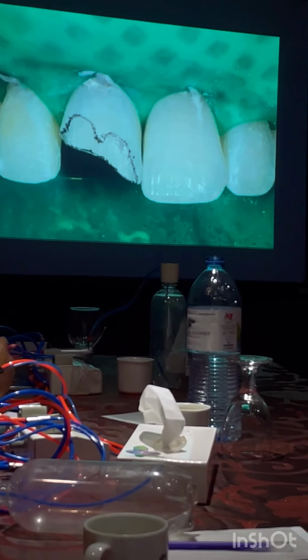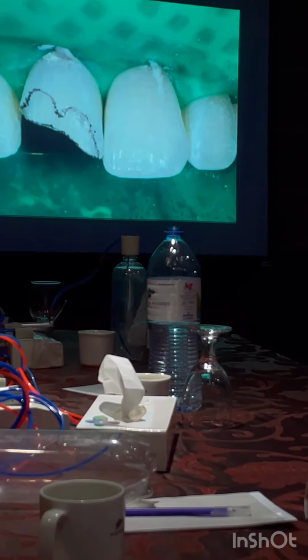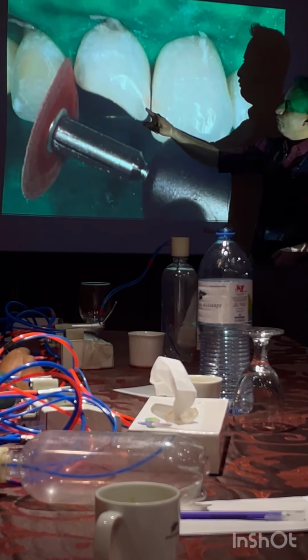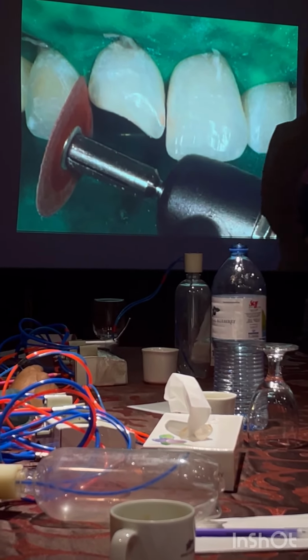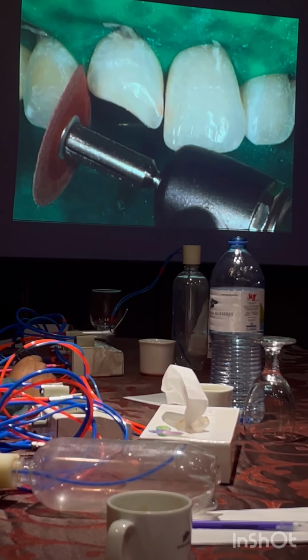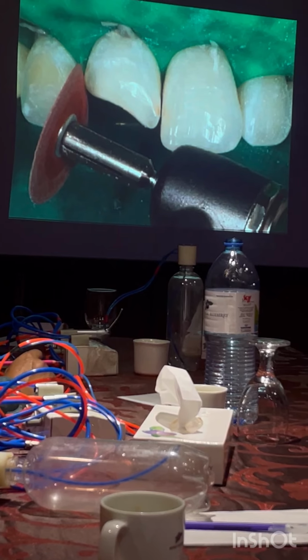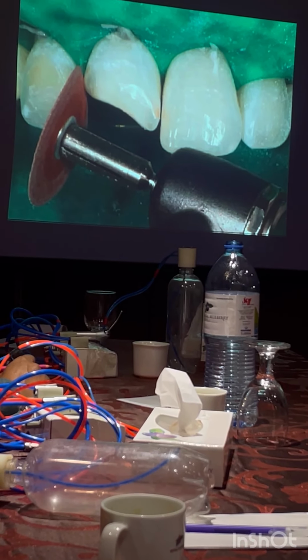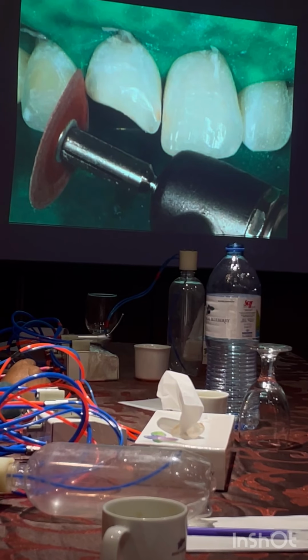Confuse the eye. Now once I give this scallop bevel, I can use a disc, soft flex, or I can use a burr. And now can all of you see the scallop bevel? So now my composite and my tooth is meeting in all directions. Now I will confuse my eye. It will not see where is the demarcation. Is it very clear?